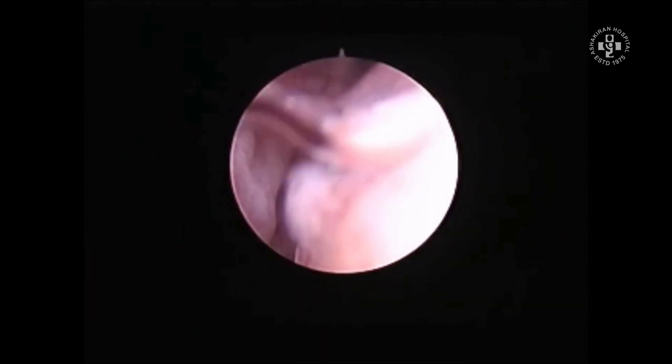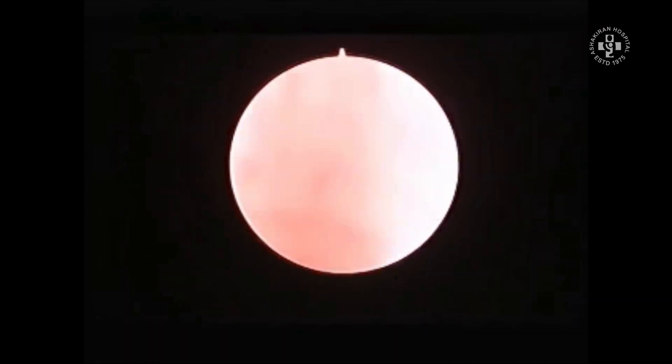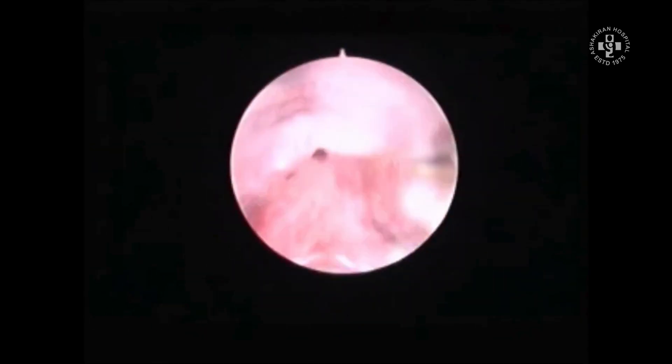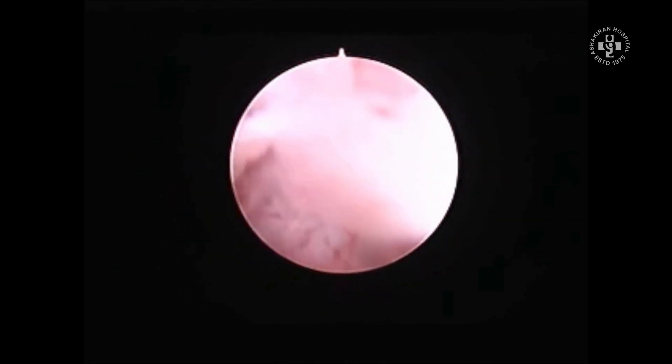While doing the fimbrioscopy you can know the architecture of the fimbria, and the same fimbrioscope can be inserted into the tube to perform falloposcopy, which gives you the inner structure of the fallopian tube. Here I am going from the fimbrial end to see where the fimbria is. You can see the beautiful architecture of the fimbria — healthy fimbria will show you dynamicity and blood vessels. This gives us a look at the flattening of the rugae or the functionality of the tube.